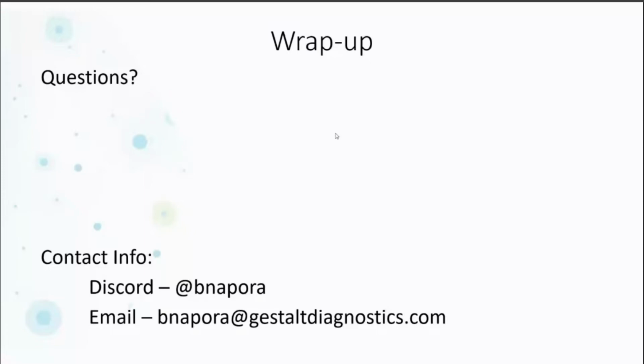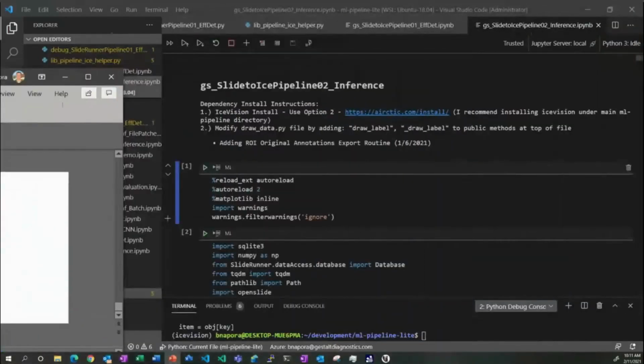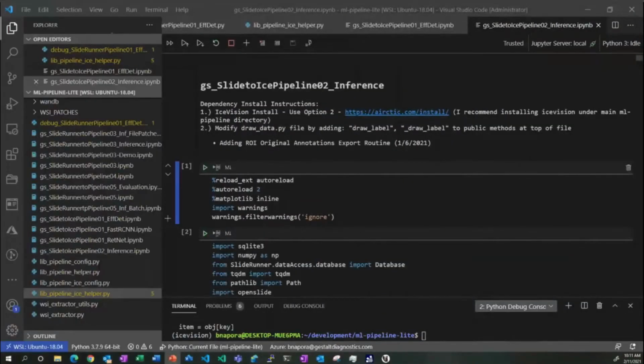But yeah, apart from the false positives, but that's the problem with the metric itself. It's biased in this sense. But one thing that you have to take into account with the average precision is that you have high scores for the large objects, and then it drops very dramatically with the small boxes.